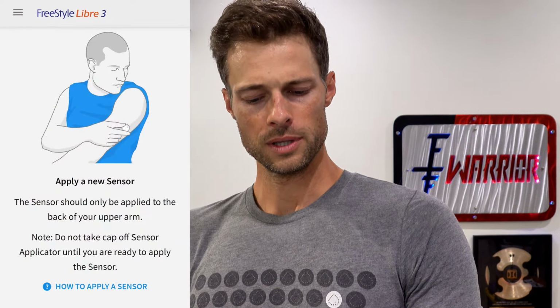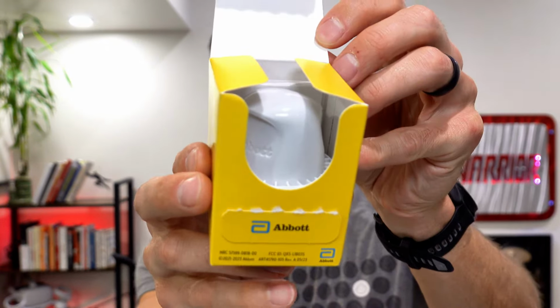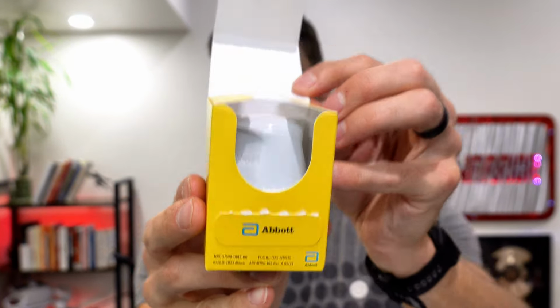All right, apply a sensor. Let's do it. Note, do not take cap off sensor applicator. All right, this is the fun part. And here's the really fun part and the reason I'm doing this at 9 o'clock at night. My Dexcom expires. Ooh, look at that. It's kind of fancy. I actually like that display. My Dexcom expires in an hour and this sensor actually expires tomorrow. And so, perfect timing. Actually let me see what my blood sugars are doing right now. It was 139, now it's 136.